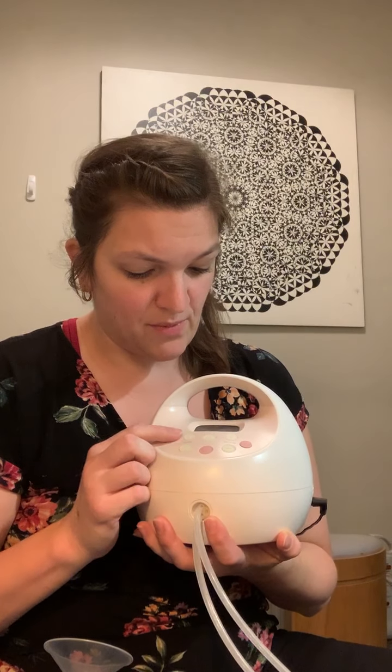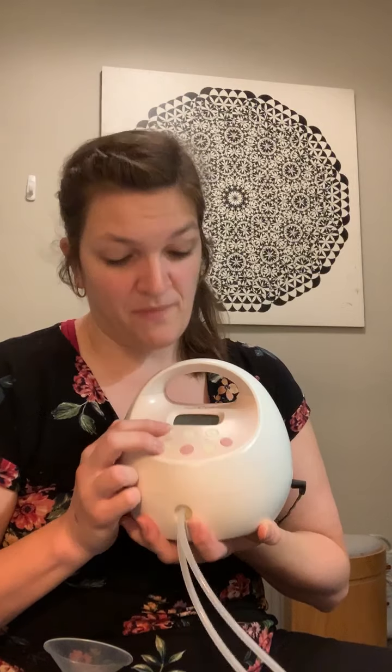Now, usually for most moms, I like to have that cycle at either 50 or 54 to maximize how your baby is pumping. If you have a newborn or a preemie and are starting out with colostrum, you can have it lower, but typically you want to have it all the way to the top. The nice thing about this pump is it does have those two modes, the stimulation and the pump mode, and you do have quite a bit of control with the vacuum. So you can go up as light or as strong as you need to with this pump, okay?